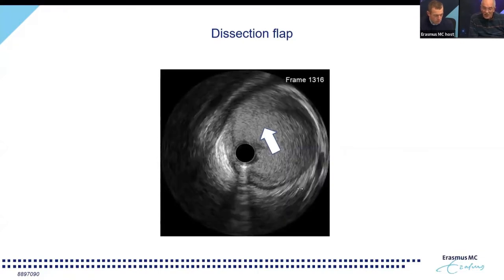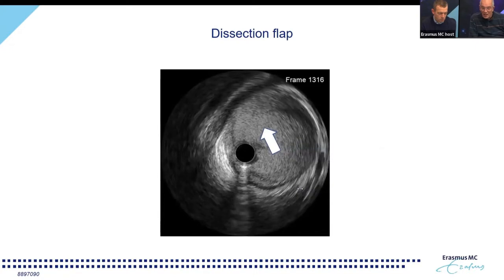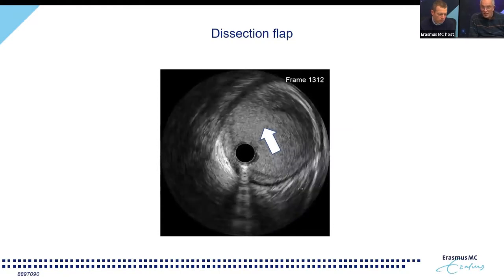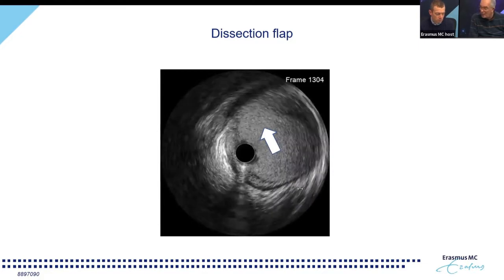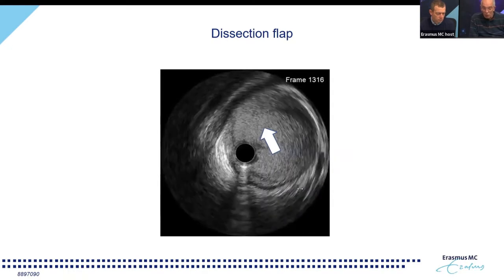And that is what we anticipated, the entrance of the hematoma. And again, it's an anterograde dissection, so the false lumen between the media and the adventitia is filling up, and that's why you see your hematoma all the way through.